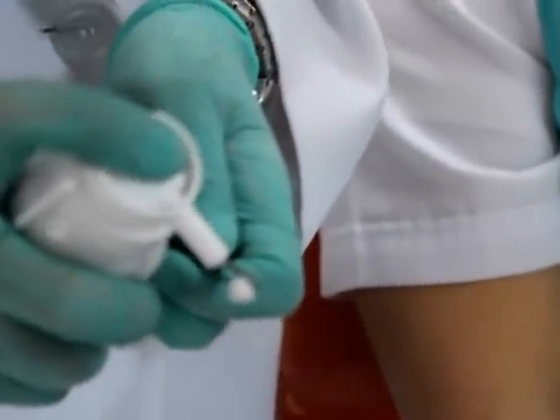You shake it well. Shake it well. And then spray. Okay? Then place it on the tooth. Now, this is the instruction to the patient. I'm going to put something cold on your tooth. If you feel something like pain or sensitivity, or it's not necessary that you feel anything, but once you feel something, please raise your right hand. If you don't feel anything already, put it back.